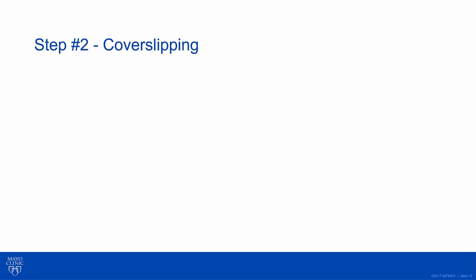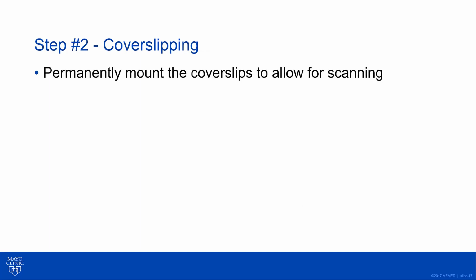We also had to change the method we used for cover slipping. We had to permanently mount the cover slips, and before this, we just used immersion oil to mount the slides, and then we discarded them afterwards. But now we need the cover slip to be on very firmly so it doesn't move around during the scanning process. And we needed a fast drying mounting medium. The previous medium, when we did permanently mount our slides, took up to 24 hours to dry.